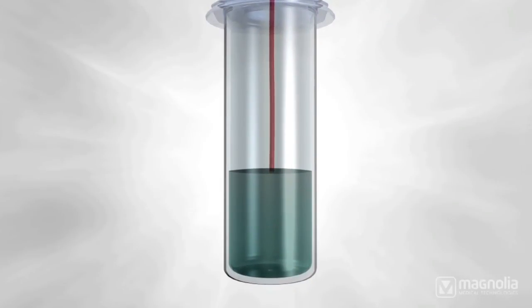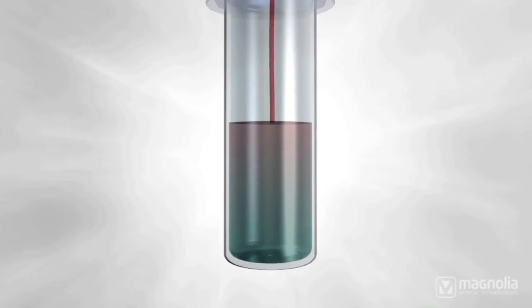Steropath is indicated to reduce the frequency of blood culture contamination by diverting and isolating initial venipuncture blood, which can contain skin-residing contaminants.